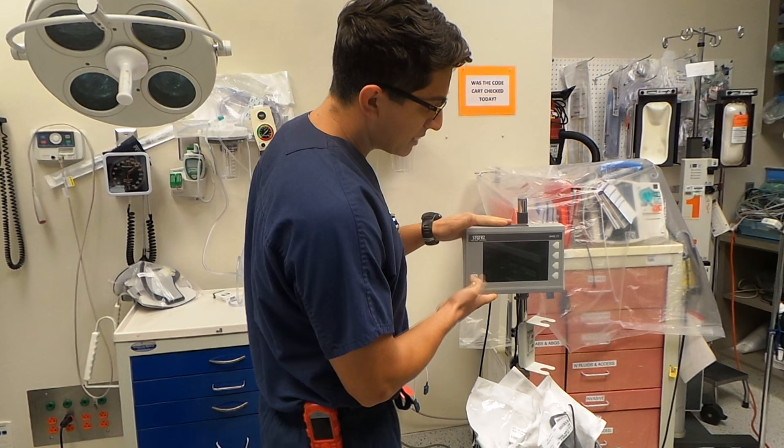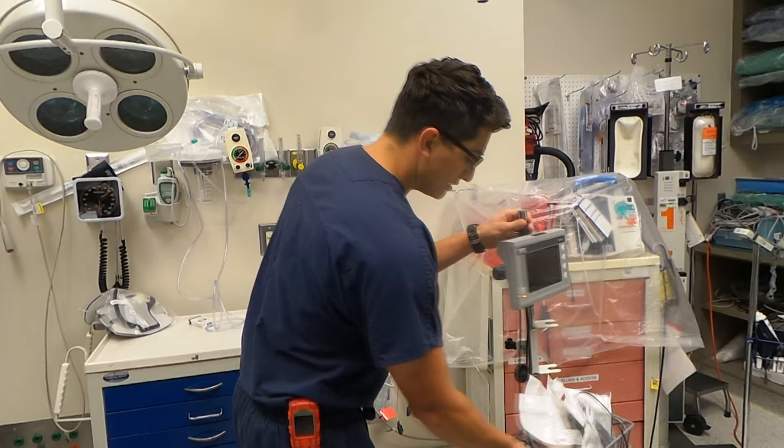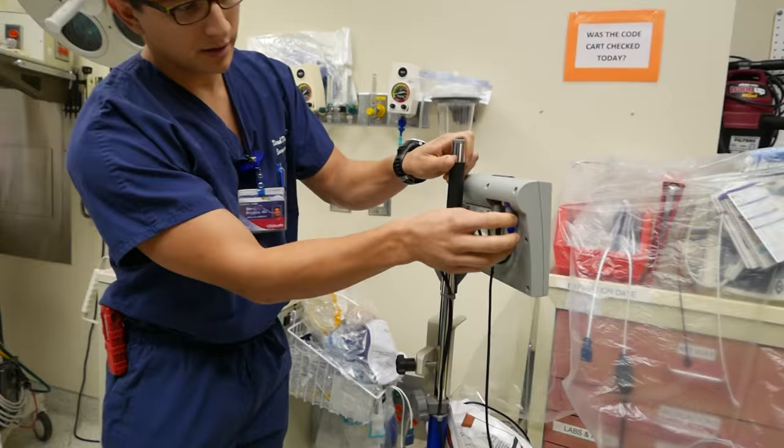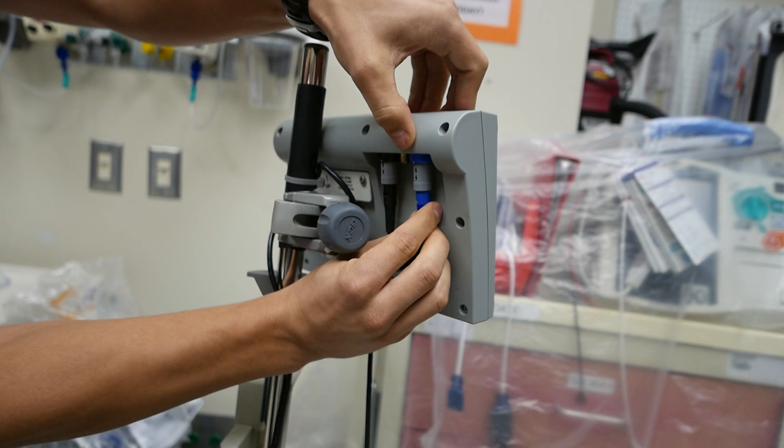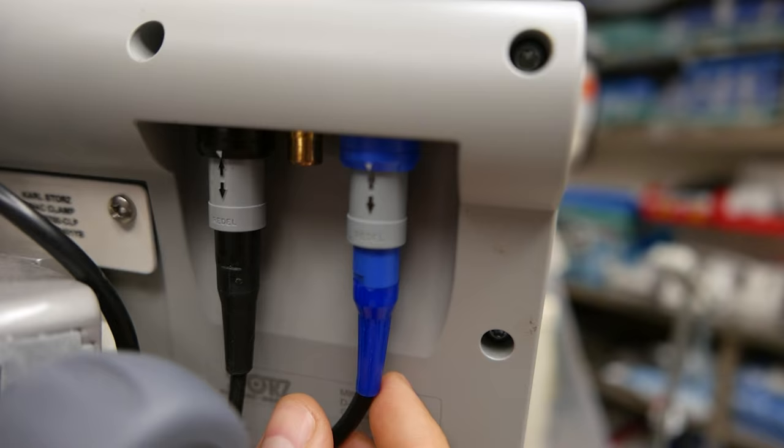This is kind of the general screen that usually comes with all these different storage devices, and they have these universal connectors in the back. You can see here there's a black arrow that kind of squeezes out like that, and it lines up with the little white arrow that's there too. One of them is for the power, and the other one is for the scope.